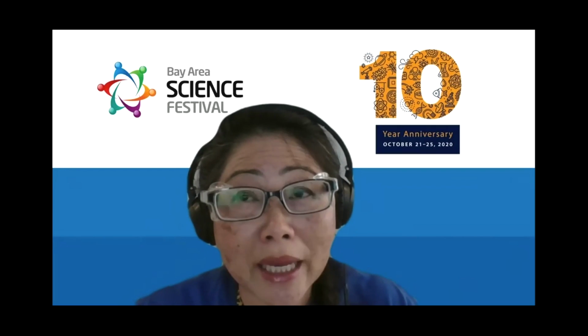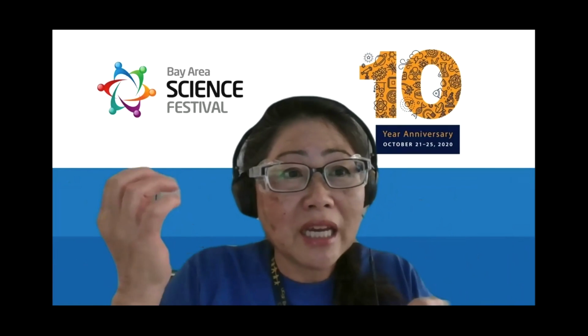Yeah, I consider working in the lab as high-tech cooking. We commonly use dry ice, liquid nitrogen, and regular ice, and we have these small instruments called pipettes. Instead of a cup or a teaspoon, we pipette or measure out microliters of material, sometimes less than a microliter. So we can do experiments in a very small tube, or in a very large plate. Those are the types of tools we use.